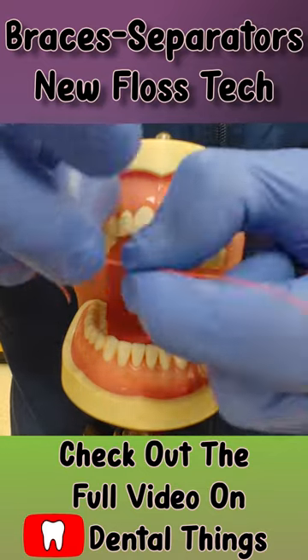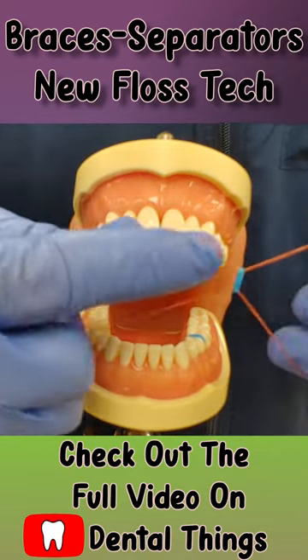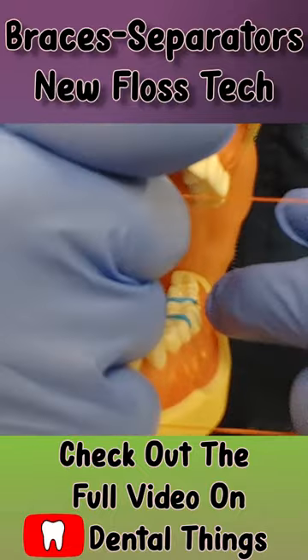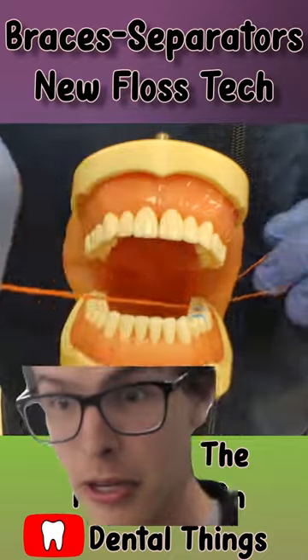Once you pop it through, pull the floss through, load another separator into place, and do the same actions — pull the two tops, pull the two bottoms — and go ahead and do another separator right next to it. That's pretty good!